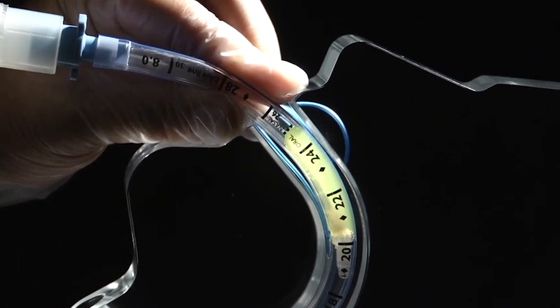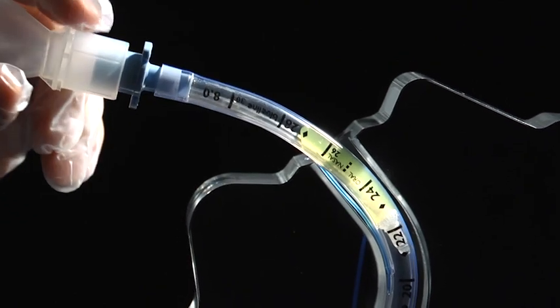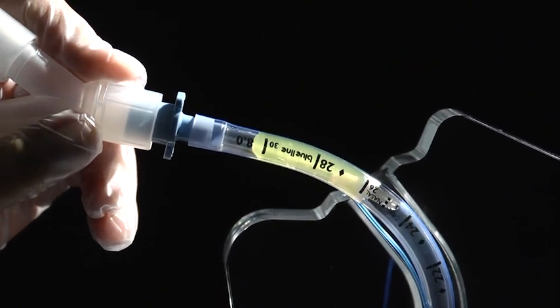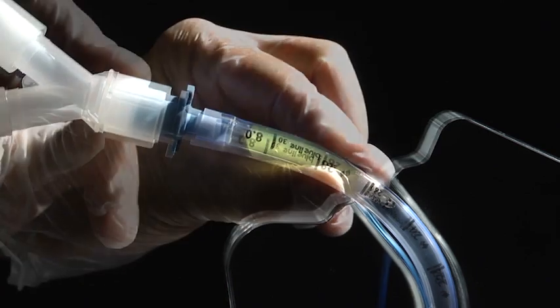In clinical practice, withdrawal would be accomplished over two to three seconds. Withdrawal is performed more slowly here for illustrative purposes.